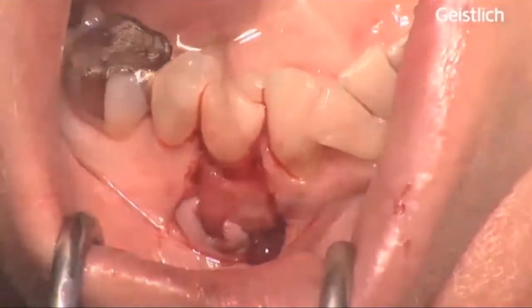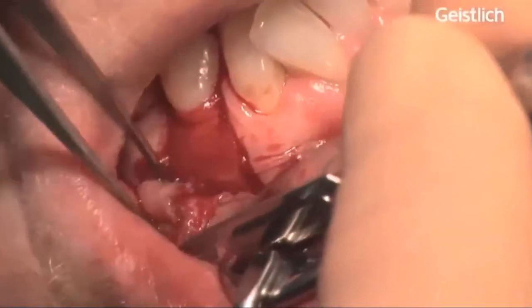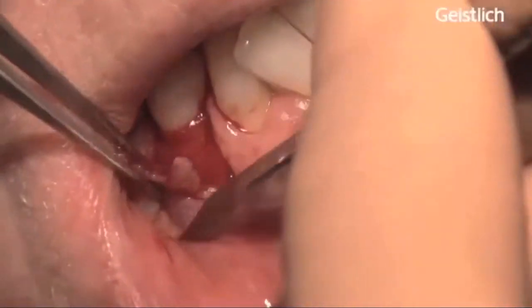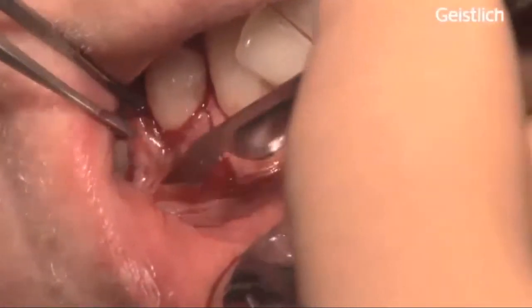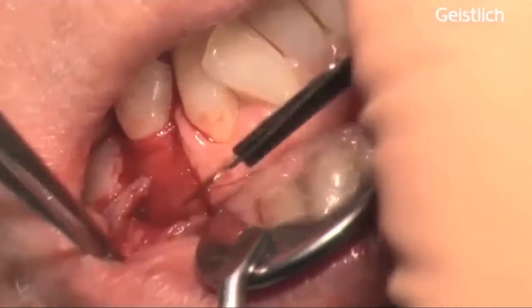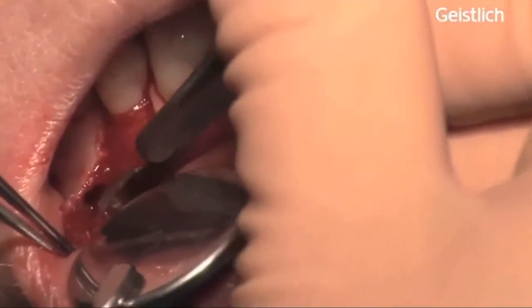Subsequently, the root surface will be covered with a coronally advanced flap. A tension-free flap is extremely difficult to achieve, especially in the lower jaw. Some additional mobilization is done so that the tissue flap can be secured slightly coronally of the CEJ.